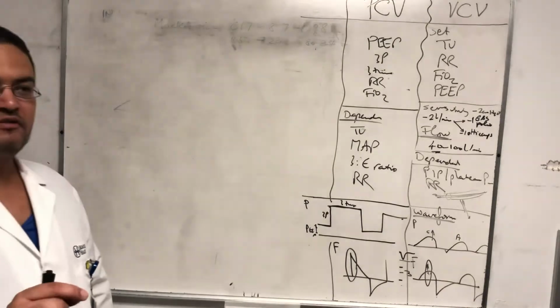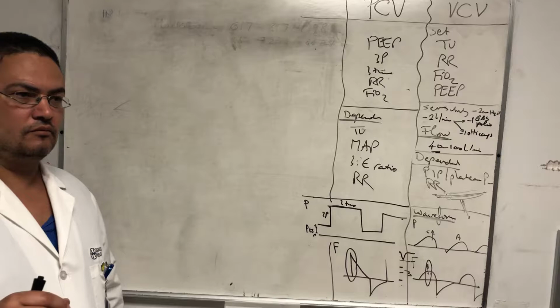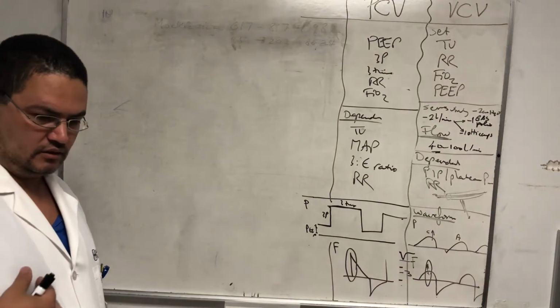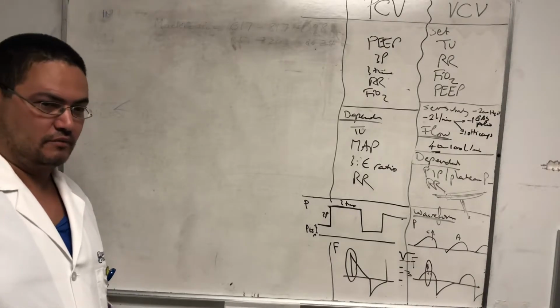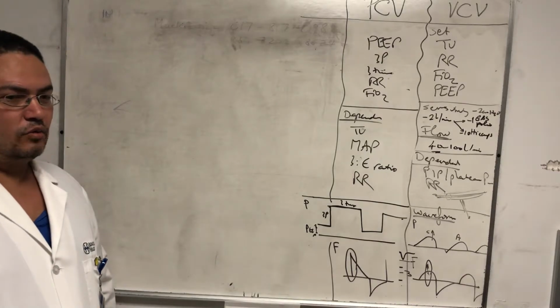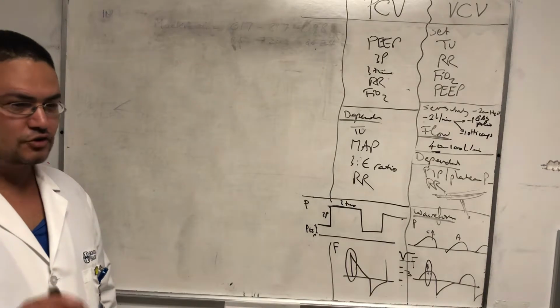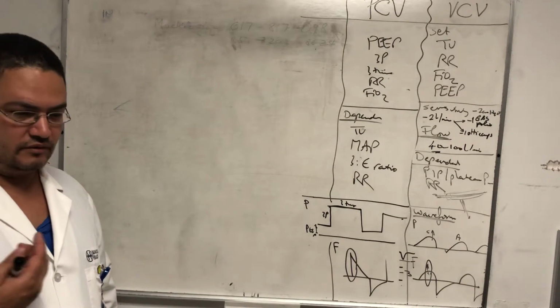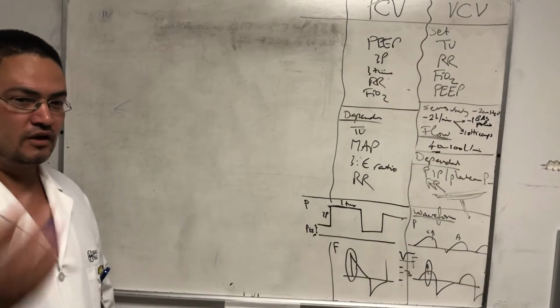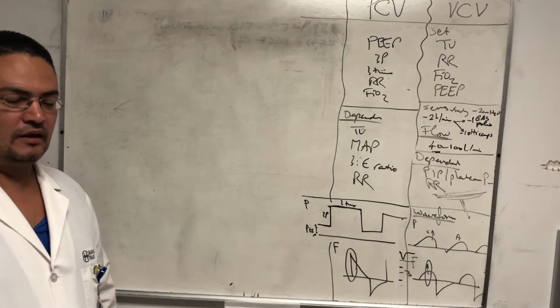When we have somebody with a bronchopleural fistula, basically half of the tidal volume, for example, is coming out the chest tube. We usually don't have a ventilation problem. We have an oxygenation problem, right? Because the ventilation is easy. The other parts of the lungs, and the other lung, are easy. You just get CO2, and it will give me more. I'll take more CO2, I'll get rid of it. It's easy to diffuse. And then the oxygen.